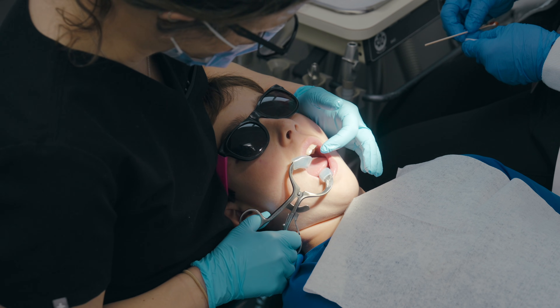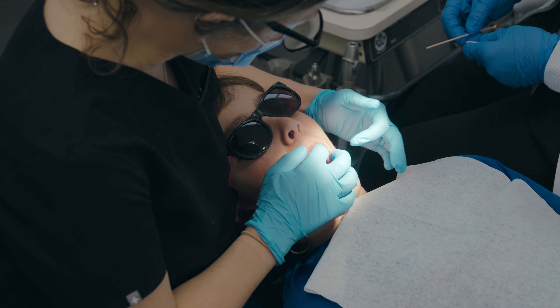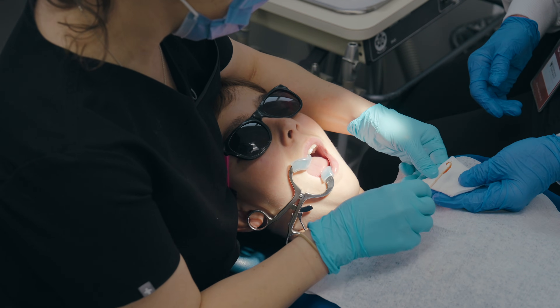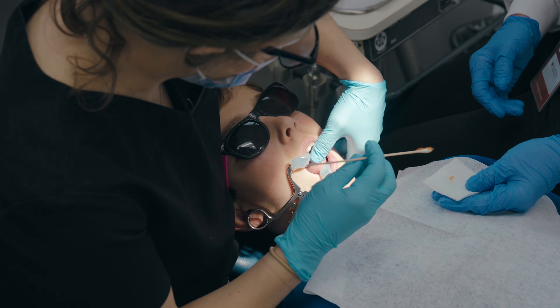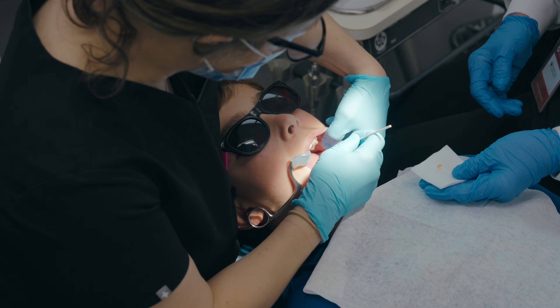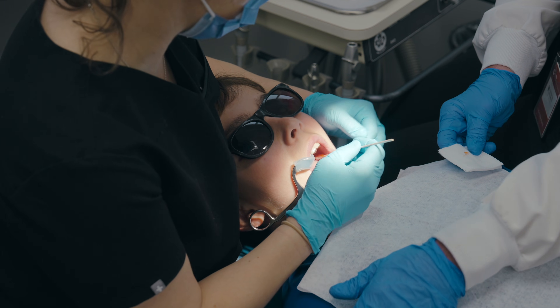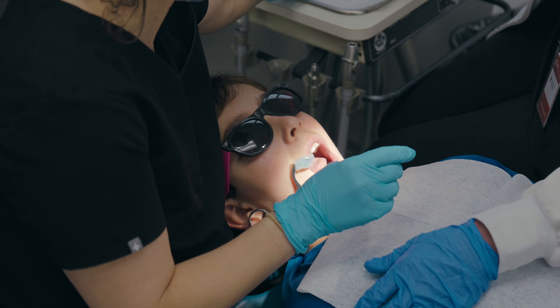A mouth prop is inserted carefully on the opposite side to where you will be injecting. After drying gently with gauze, topical anesthesia is applied to the soft tissues where you will insert the needle. Be careful not to allow the patient to get too much of the taste, as it can be quite bitter or sour tasting.